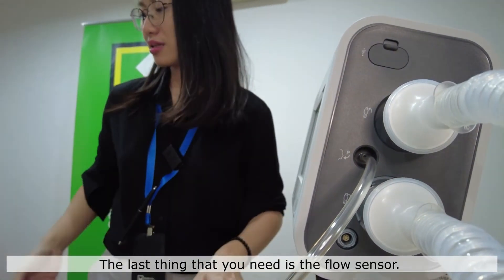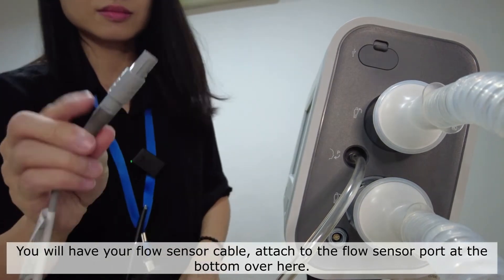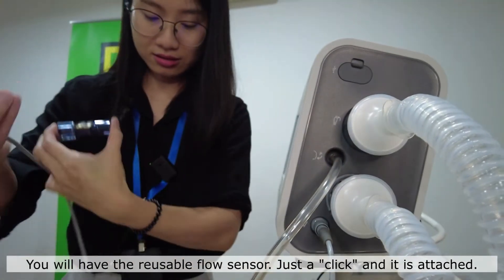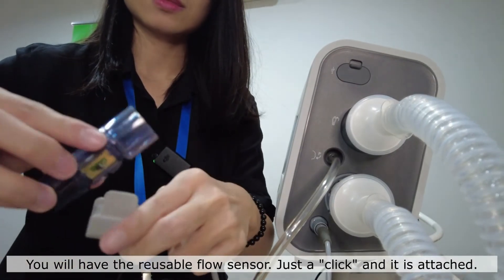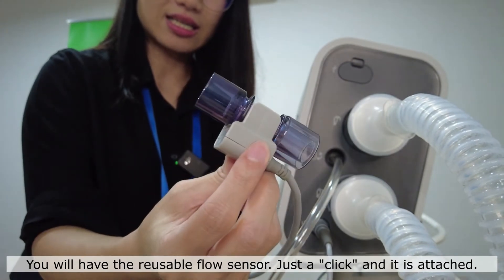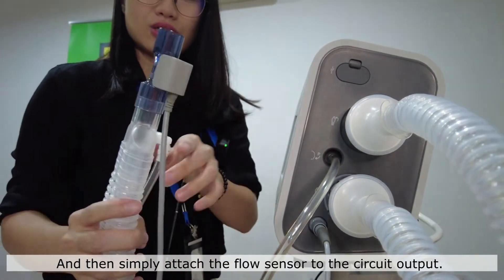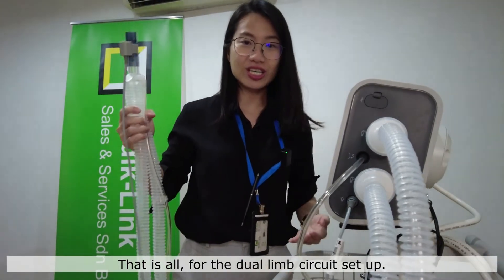The last thing that you need is the Flow Sensor. You will have your Flow Sensor cable attached to the Flow Sensor port at the bottom. You will have the reusable Flow Sensor — this is how you attach it, just a click and it is attached. Then simply attach this Flow Sensor to your circuit output. That is all for the dual limb circuit setup.